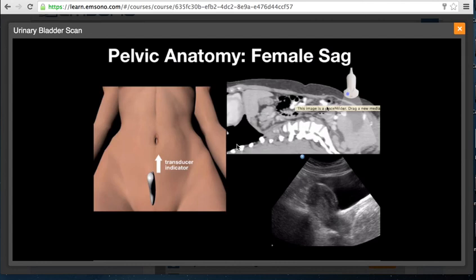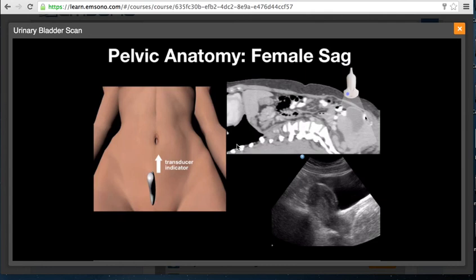A sagittal CT cut through the abdomen and pelvis helps explain the pelvic ultrasound image: indicator toward the patient's head, urinary bladder anteriorly, uterus, bowel, and cul-de-sac, with the pubic symphysis in the caudal direction. On the ultrasound image you have anterior, posterior, head, and foot orientation with the uterus and urinary bladder visible. If the main goal is to evaluate the urinary bladder, make sure to slide the transducer slightly more caudally so you can see the full length of the urinary bladder, as in this view it is cut off slightly.